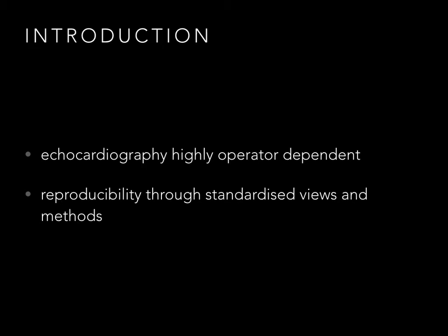Real-time echocardiography allows the assessment of cardiac morphology, function and pathology. Echocardiography is very operator dependent. Therefore, it is important to standardize views, images, and measurements, both for accuracy and reproducibility.